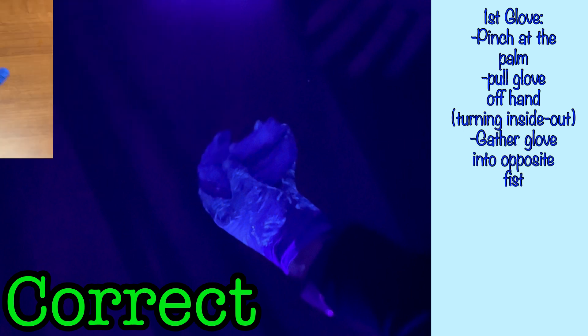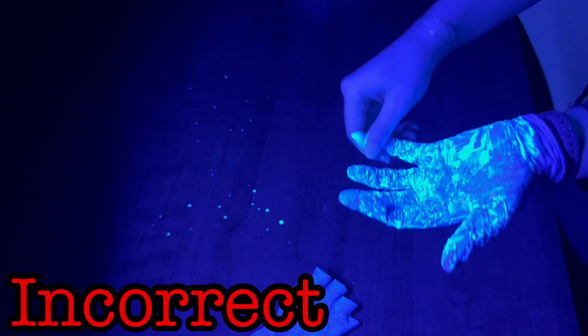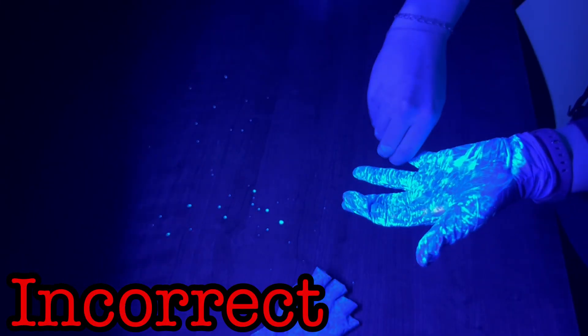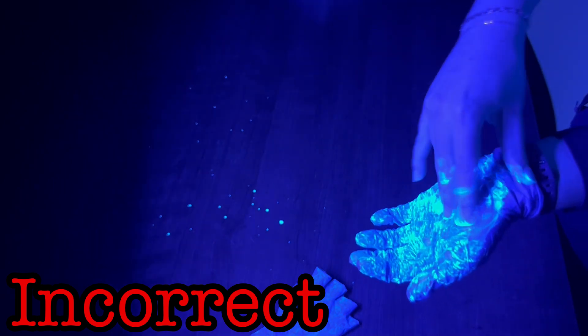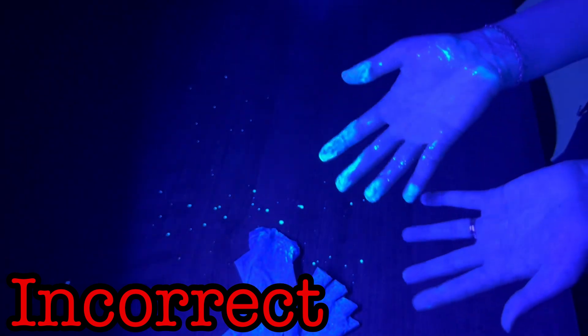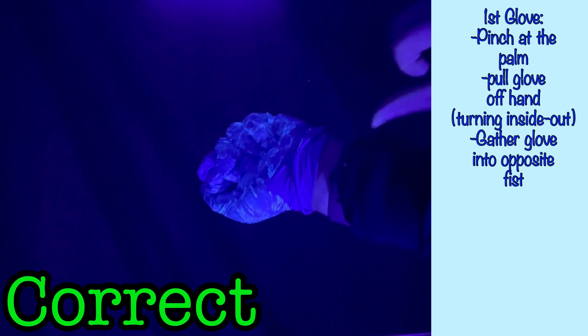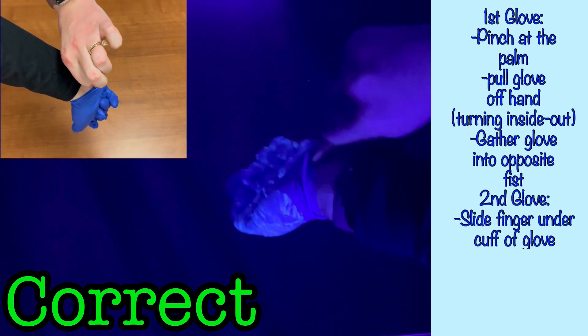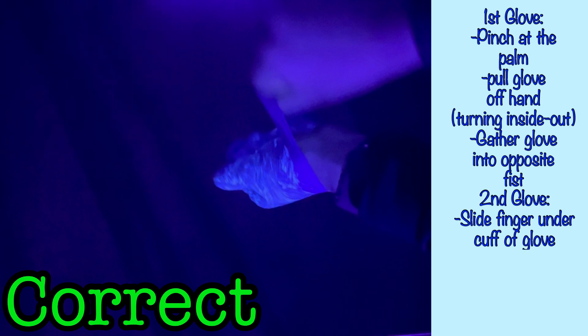Next, gather the doffed glove in the fist of the still-gloved hand. In the incorrect example, we saw the wearer remove the second glove by attempting to grasp the contaminated outside surface of the second glove with her ungloved hand, and in the process significantly contaminated her bare hand. The correct method that would avoid this issue is to use your thumb or finger and slide it up your wrist under the glove's cuff. Be careful only to touch the inside of the glove with your hand, not the contaminated outer surface. Your uncontaminated finger should only touch the uncontaminated inner surface of the glove.